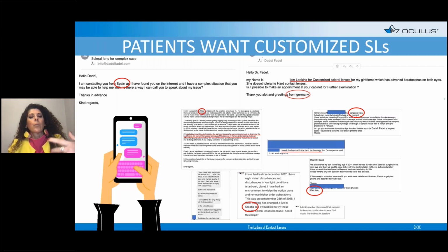Also, when I used to fit international patients, follow-ups were indeed an issue, because these patients could come for the lens fitting, but they couldn't spend further money to come back for the regular follow-ups. So every time I had to search for a local doctor to follow up with them and understand if the fitting is still good or needs some changes. Also, because the ocular surface has some changes with time.